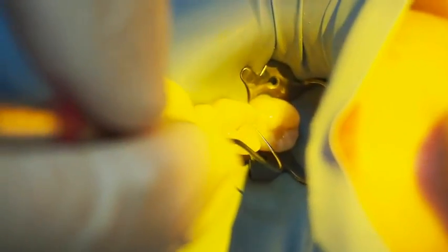I always put a little drop of flowable before I apply any of the composite resin — just one cusp at a time. I've already built up the floor in this video; you can't see that bit as my hand was in the way the entire time. A microbrush to gently shape the blob into the right shape, and then a simple probe to do the fine details. The probe here is lying sideways on the cusp so that it follows the same angle as the inclines of the cusp — if you have the buccal cusp incline meeting the lingual cusp incline.